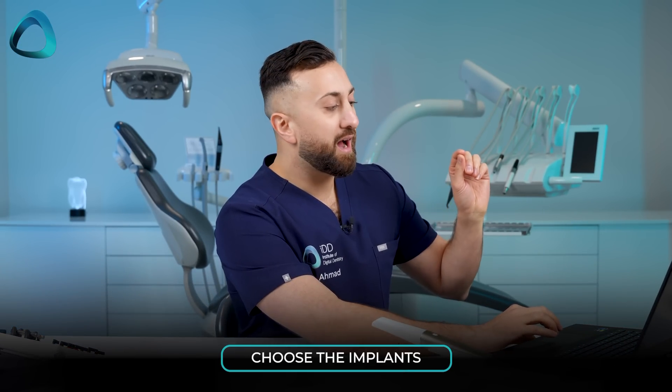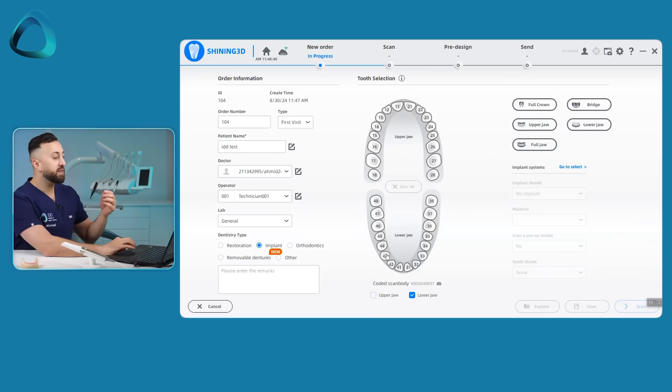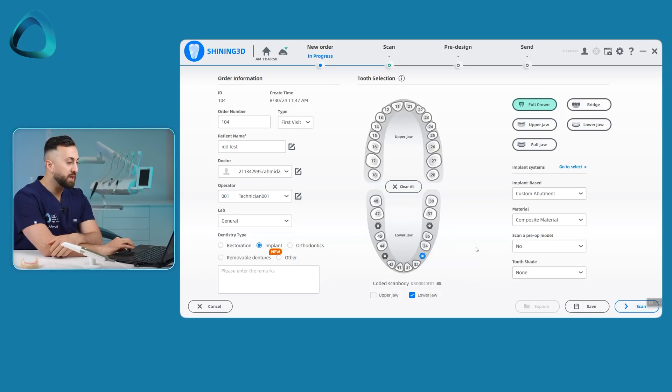The next thing to do is to choose the implants, or denote on the software how many implants there are and the rough positions of them. So we're going to click over here, click over here, click over here, and click over here — pretty stock standard all-on-four treatment there.